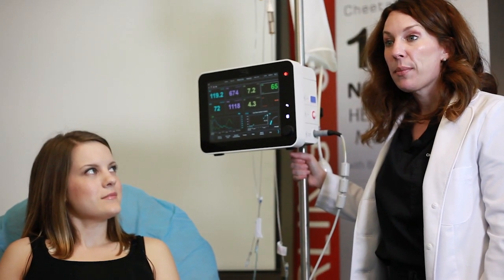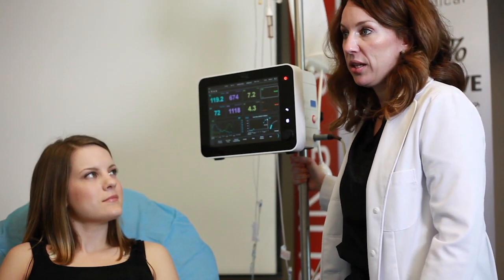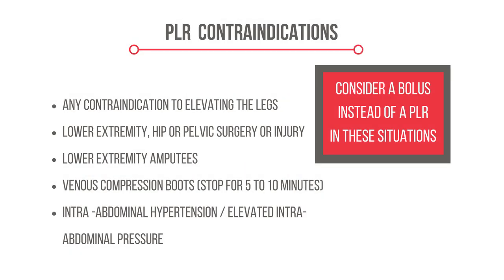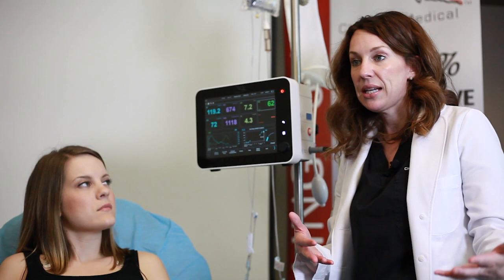Okay, so before we talk about how to do a bolus challenge, let's talk about some of the things that can give us a potential false negative when we're doing a passive leg raise. So this could be very benign, like we forgot to turn off our SCDs potentially, or it could be something like our patient has increased abdominal pressure. So really anything that's going to impede that quick flow of blood from her calves back up to her heart could potentially cause a false negative result. So in those cases, it would really just be better if you went ahead and performed a bolus dynamic assessment instead of doing a passive leg raise.